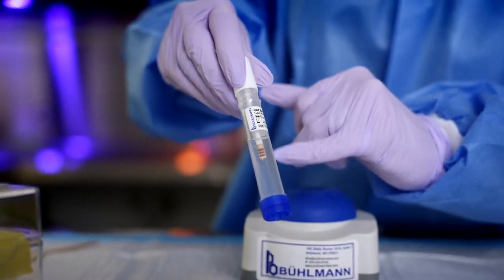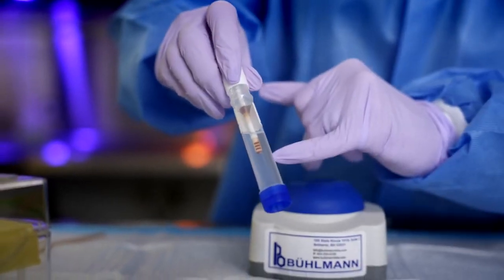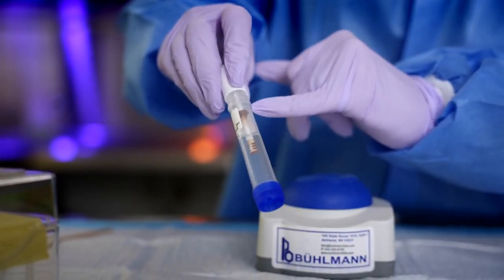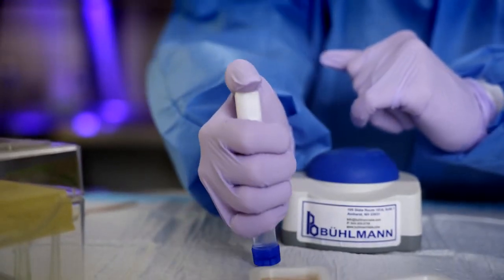Now this is important — this is where I want to ensure that all six grooves are completely filled with stool. If any of the grooves are not completely filled, please discard the Calix CAP and open a new one and repeat the sampling process above.